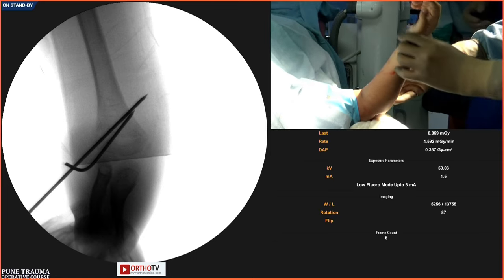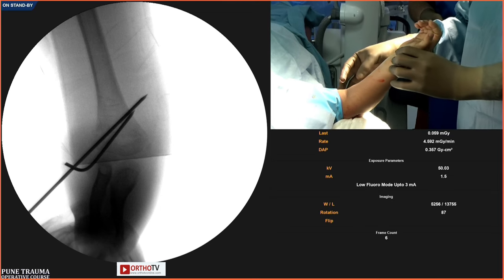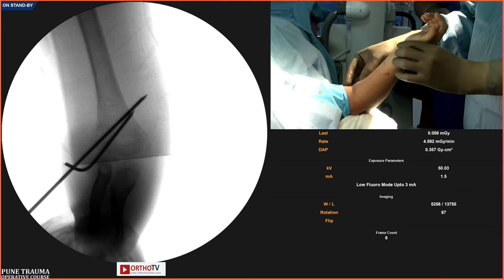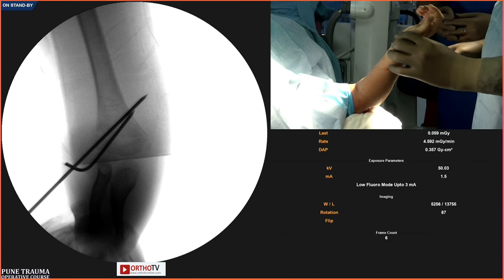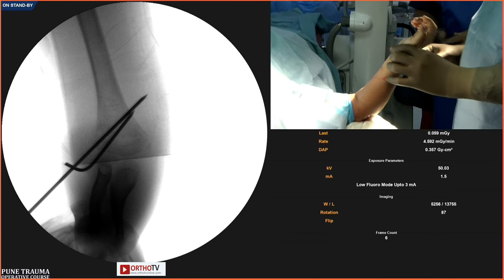Now to answer Dr. Kakatkar's question, anybody who has an oblique fracture where the medial condyle is a larger chunk, cross pinning becomes mandatory. The first pin you will always put is your lateral pin to achieve relative stability.